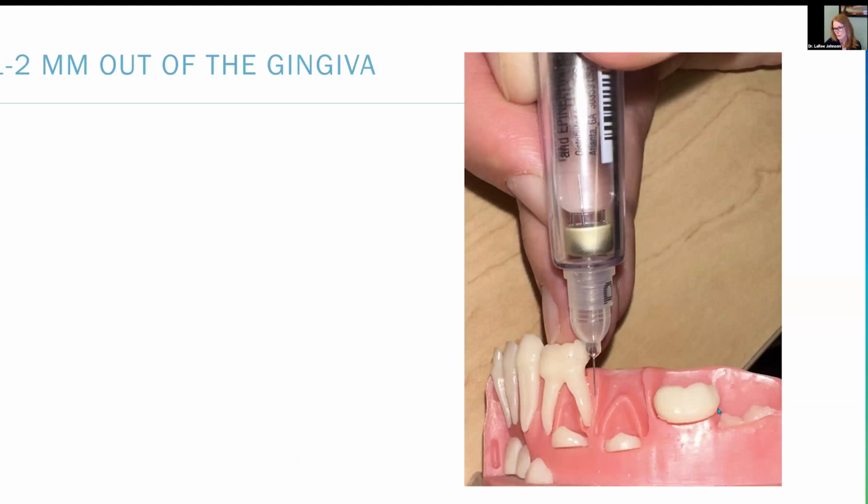This is primary or mixed dentition model. But what we can see here is with these devices, because we are not injecting through muscles and massive soft tissue, you can get that hub right to 1 to 2 millimeters sticking out, where I caution you never to go less than 5 millimeters with a conventional injection. Hub separations are a real deal, and you don't want to be involved with that. And that's basically what you're doing. You're going right between the teeth and delivering the anesthetic there, because these are primary teeth.